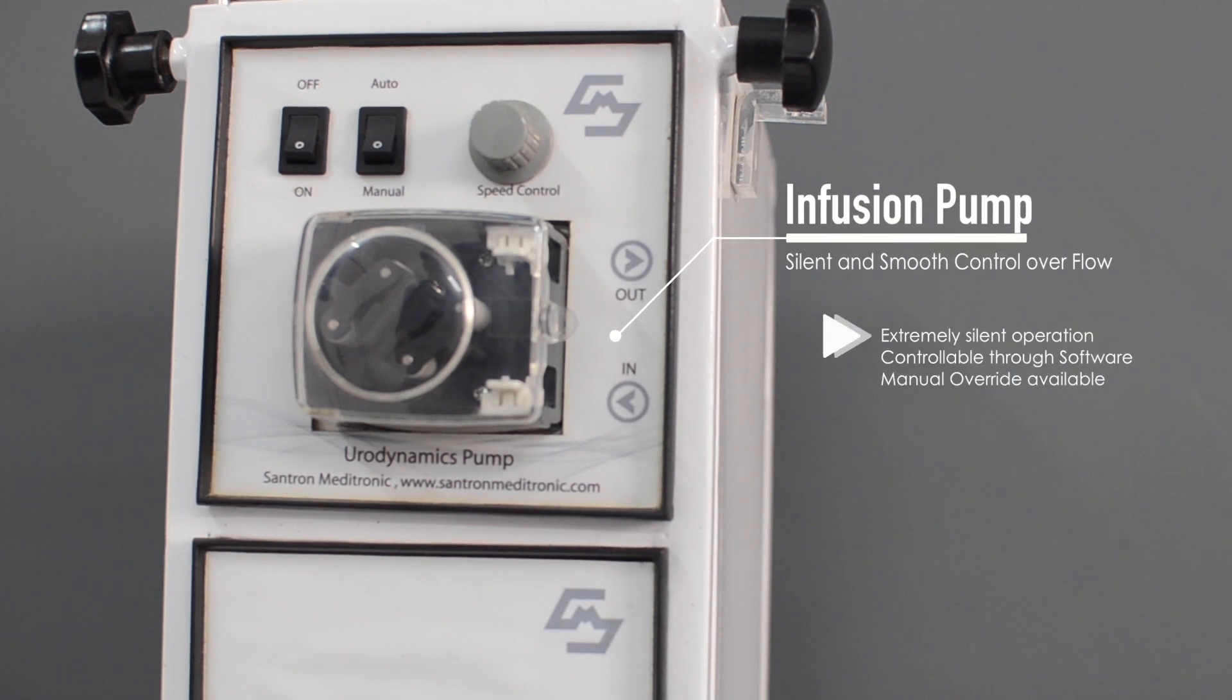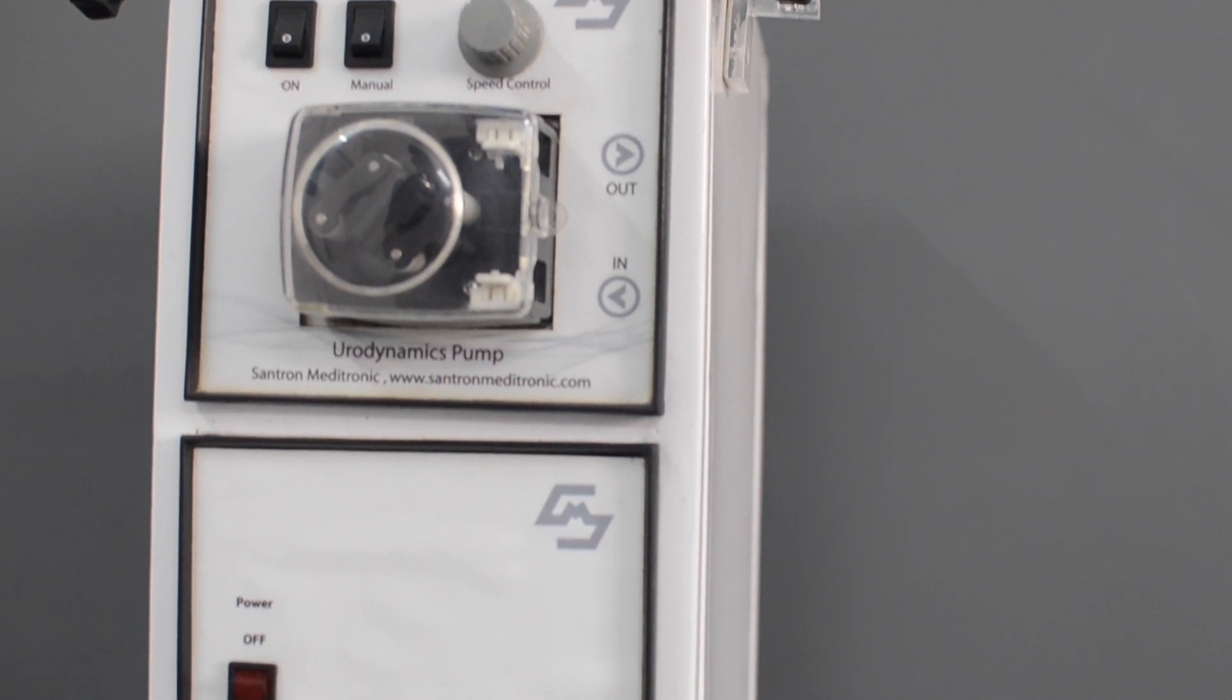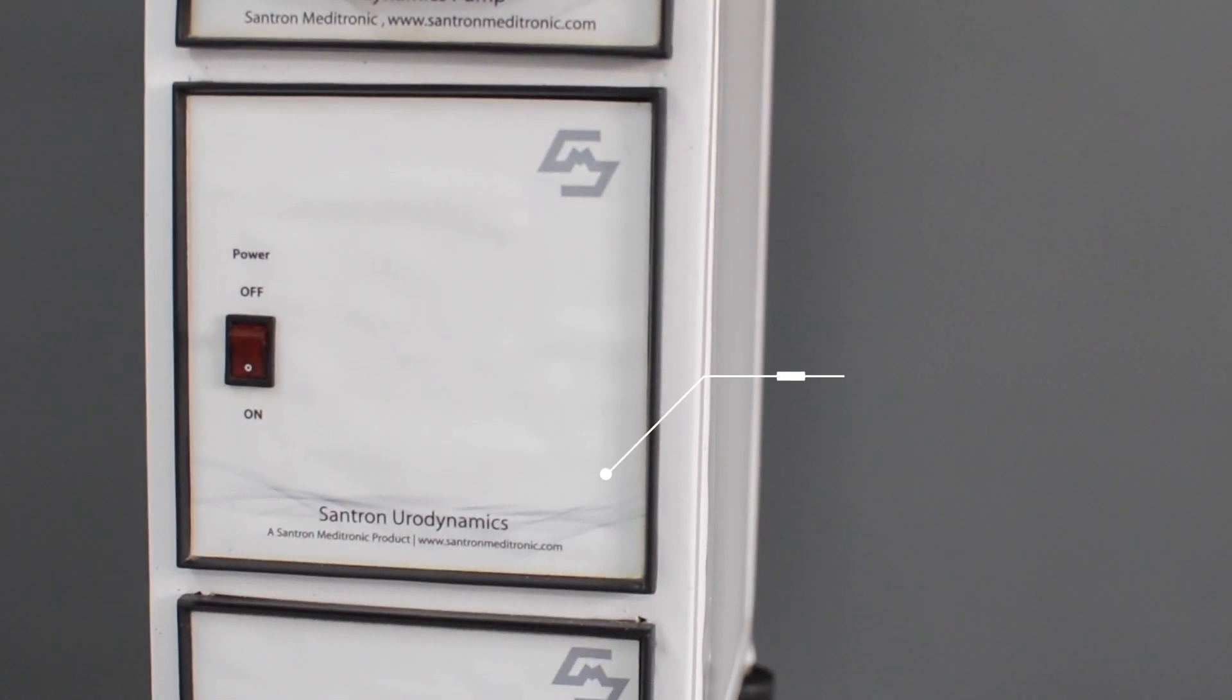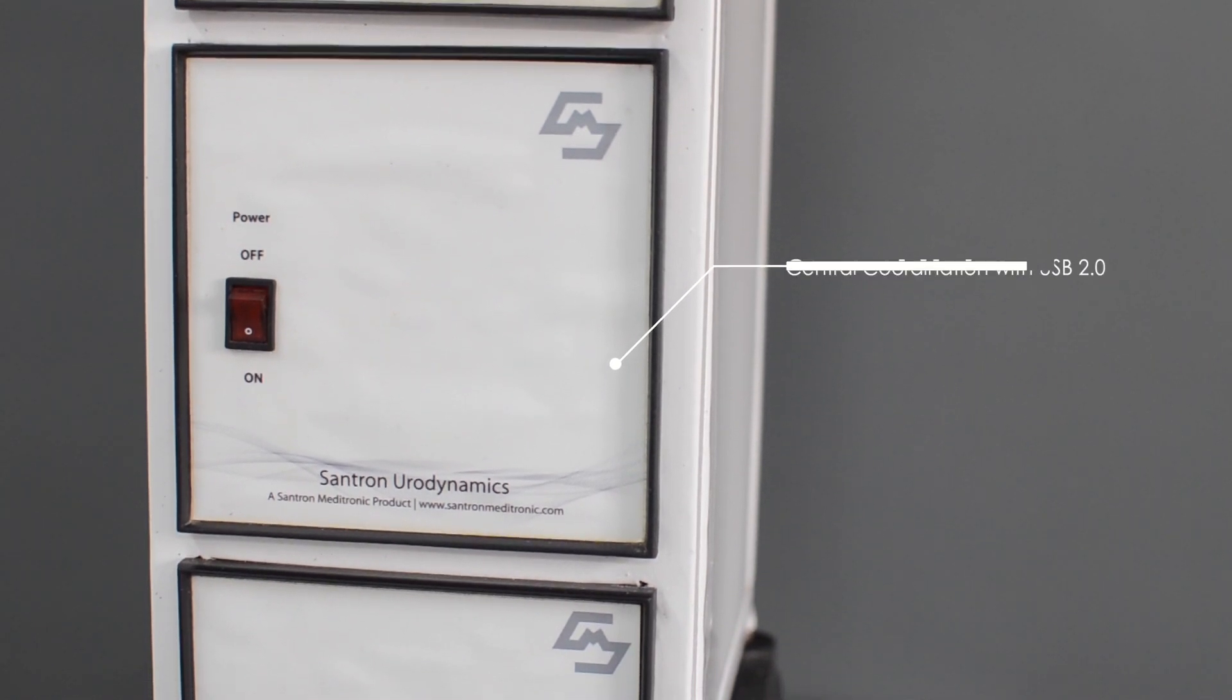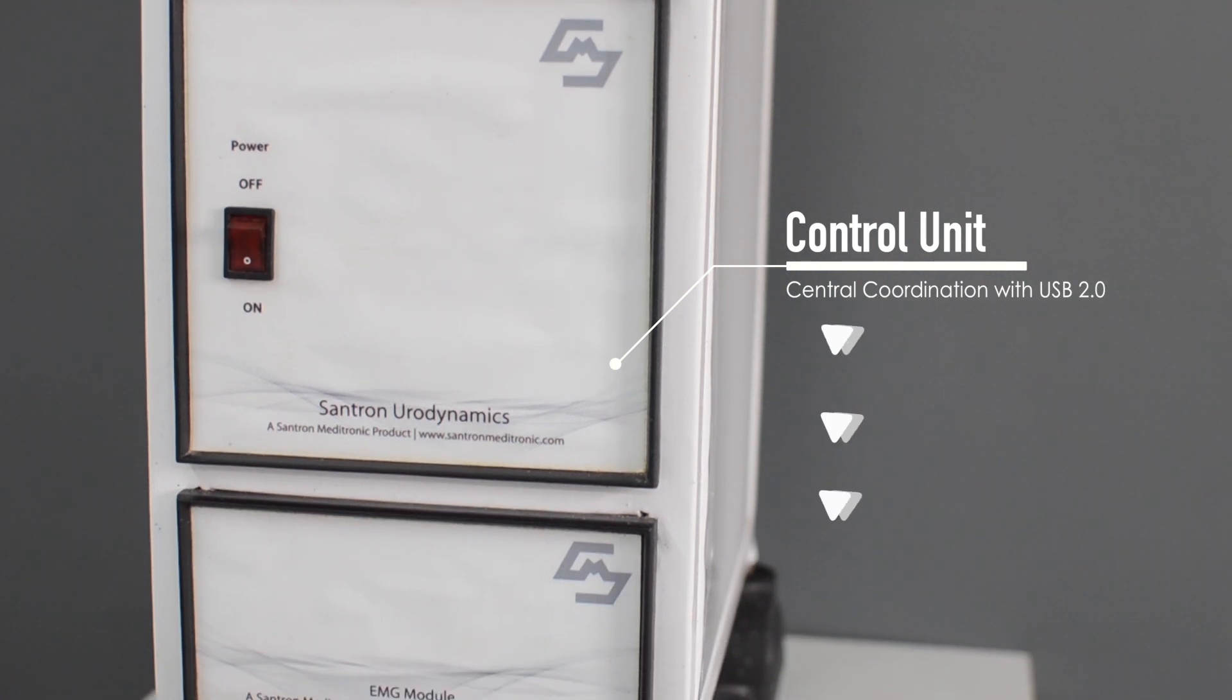The central control unit of the UDS system is powered by USB 2.0. It's a module based system with high quality surge protection.